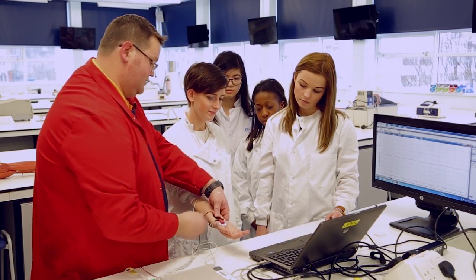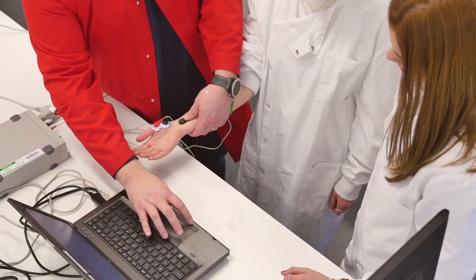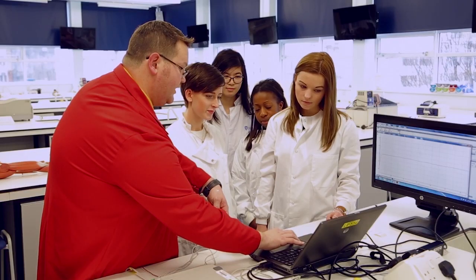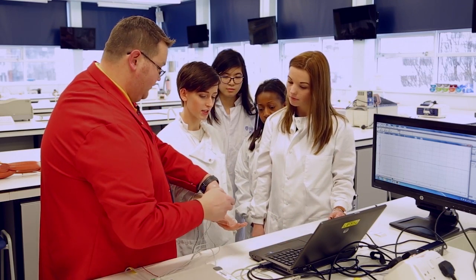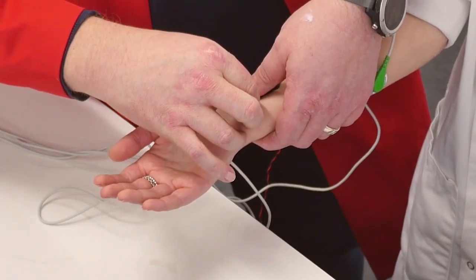If I can just pick your arm up, we'll go to there. If you can't see anything on the screen it could be that the stimulus isn't strong enough. Whereabouts can you feel the stimulus? You can feel it down the middle finger — okay, so it may be that we just need to come across a little bit.